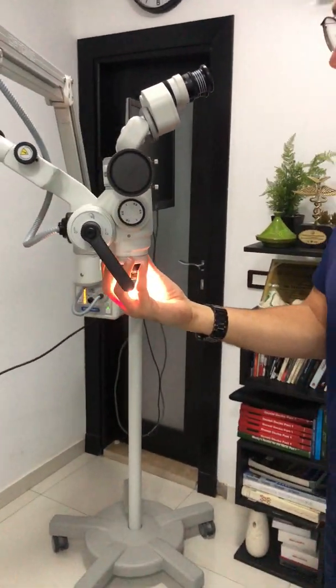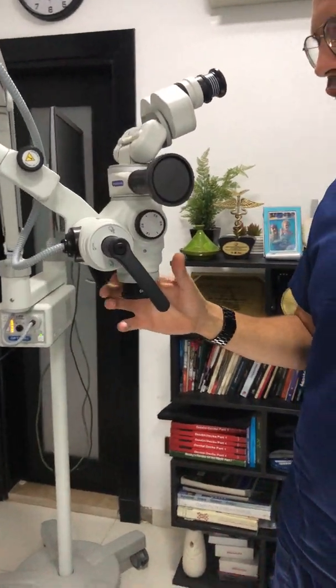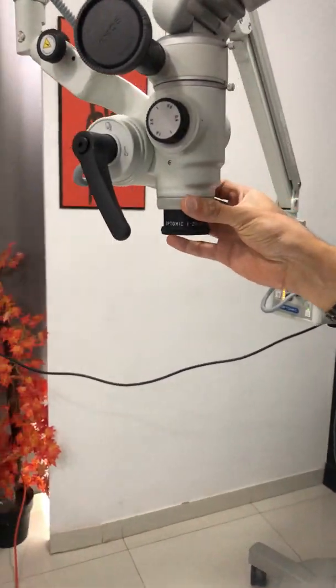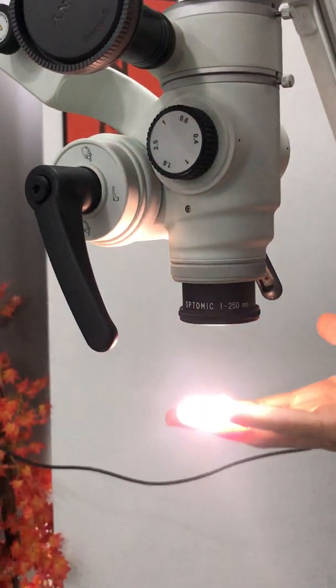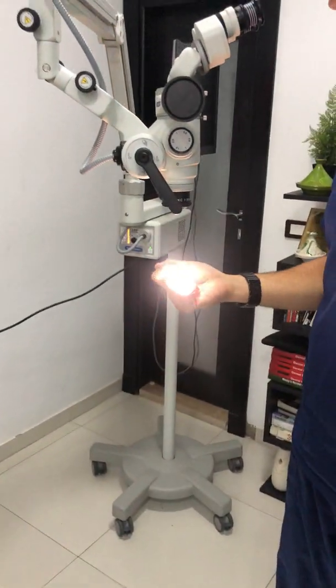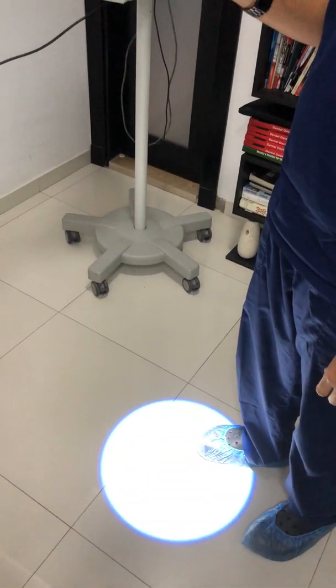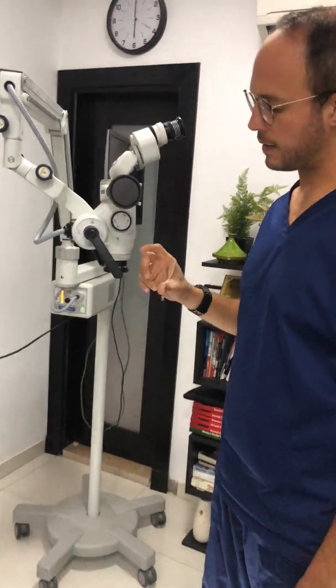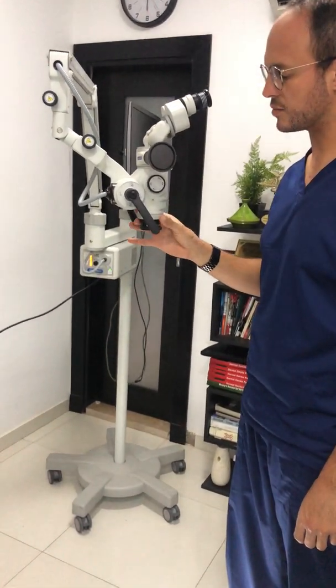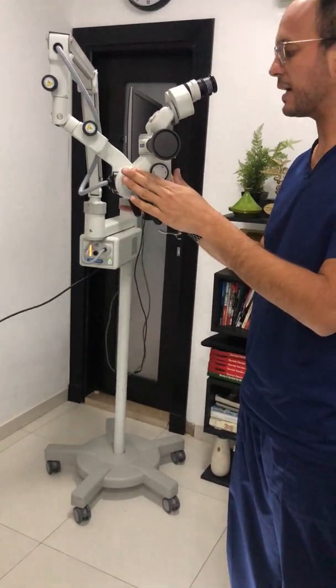Another thing is that the microscope comes only with fixed prime lenses — no variable focus lenses. It gives very good clarity and high light intensity, but the lack of a variable objective that changes focal length in working practice is really a negative side.